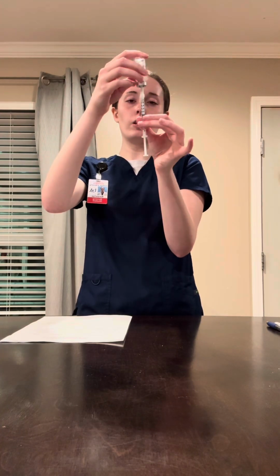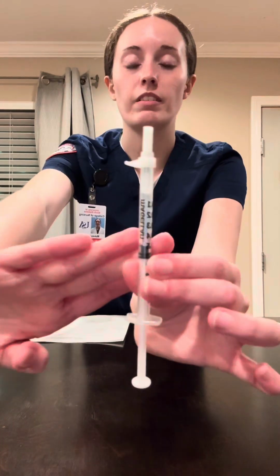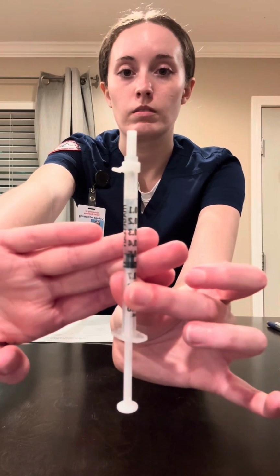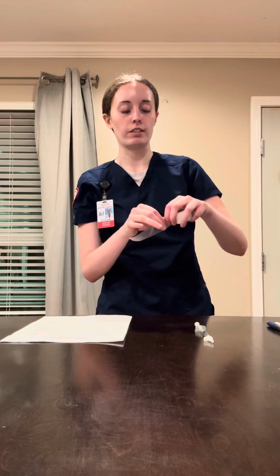Okay, so now that I have that drawn up, I'm just going to place the safety syringe on. Okay, so here's the 0.5 milliliters of heparin. Okay, so I'm going to place that down. It's not contaminated because I have the safety syringe up. So this is where I perform my second check of the 7 rights of medication administration. So I'm going to create a label.